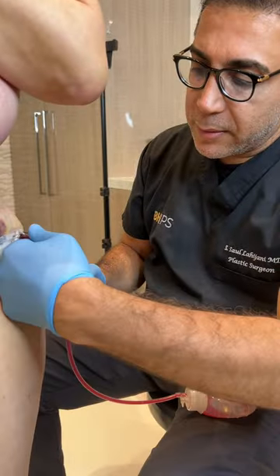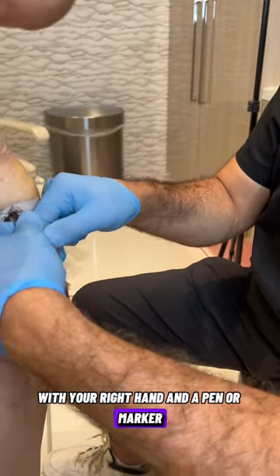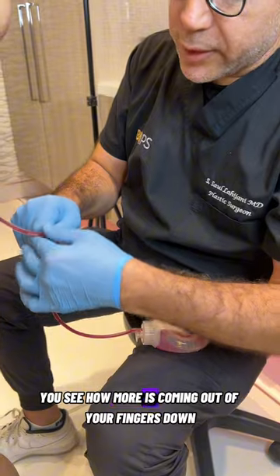Left hand, place it here so it doesn't pull out. With your right hand and a pen or marker, just milk the tube. Do you see how more is coming out?